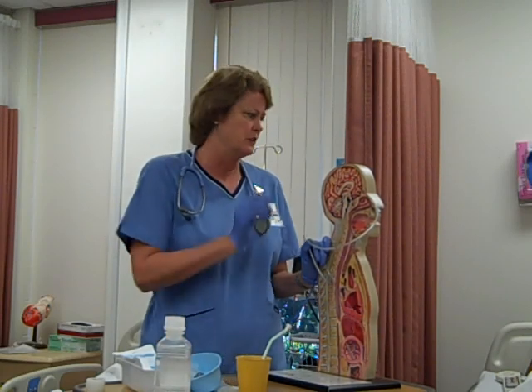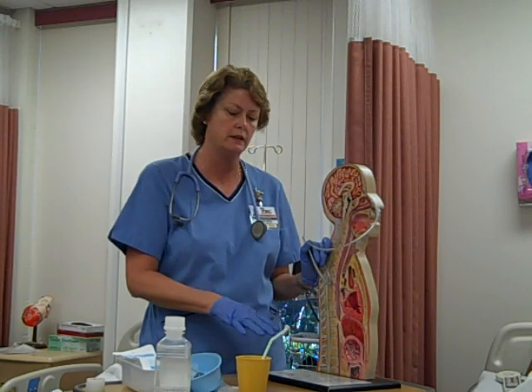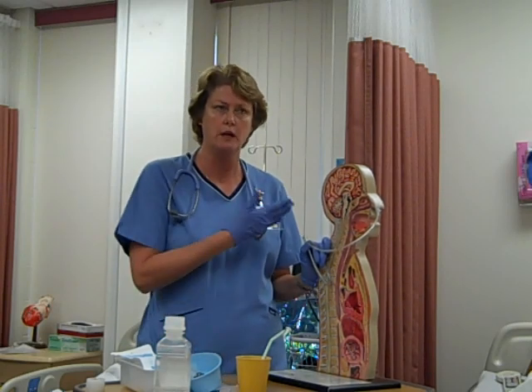You would be sure to document all of that. Assess the patient's abdomen again — if they were distended to start with, are they less distended now? Do they have bowel sounds? Check all of that again. Put the patient's bed down, keep them safe, make sure they're comfortable. Then document everything: what size tube you put in, what kind of contents you got back, what color and consistency, and whether you hooked it up to suction or just clamped it.